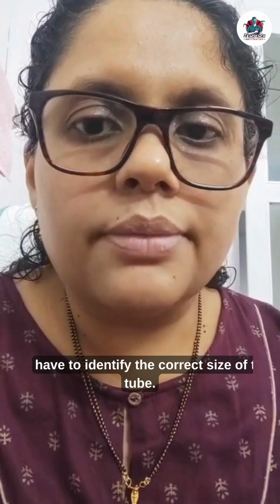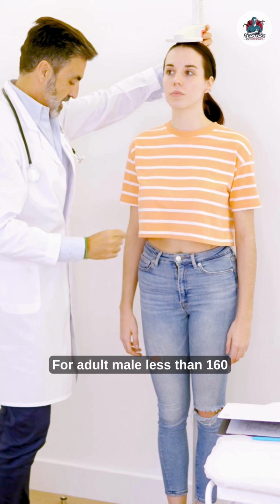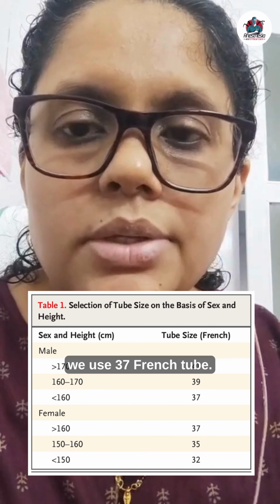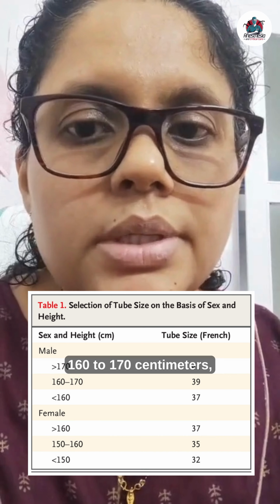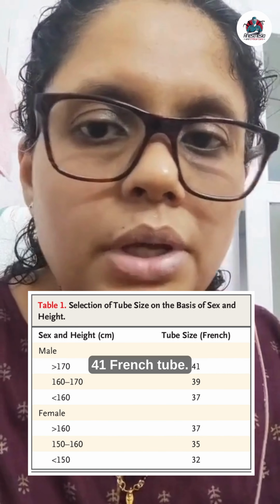So how to identify the correct size of the tube? You have to see the height of the patient. For adult males less than 160 centimeters, we use a 37 French tube. 160 to 170 centimeters, 39 French tube. More than 170 centimeters, 41 French tube.